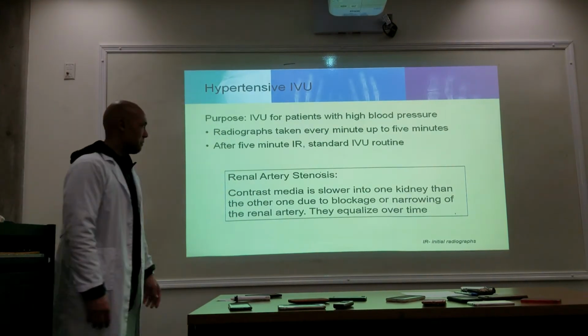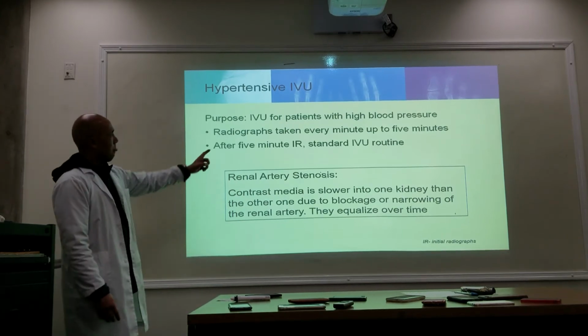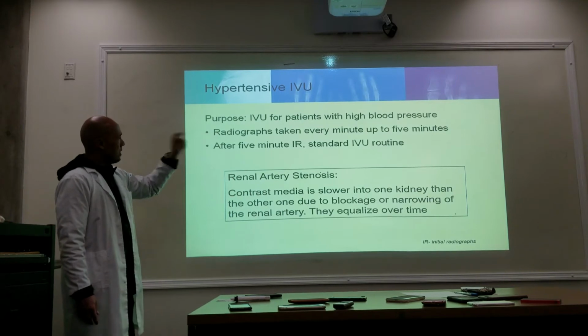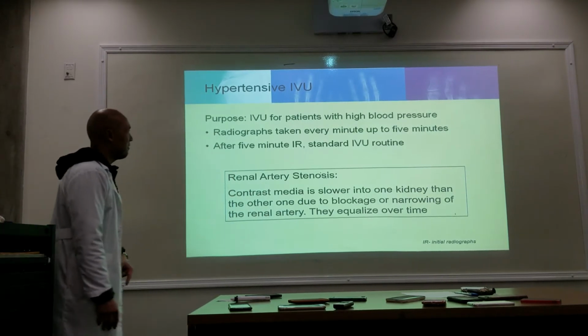Hypertensive IVU. This is just a variation of doing the IVU in that now, after your initial shot, you're going to be taking one every minute. One every minute for the first 5 minutes.